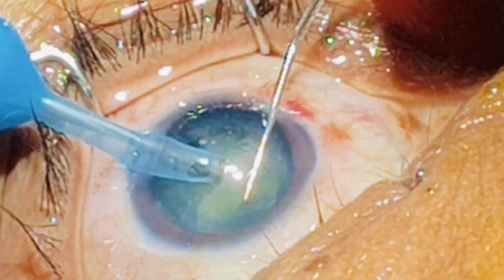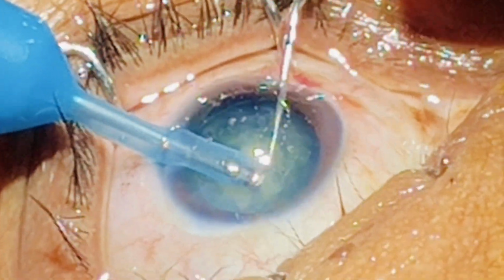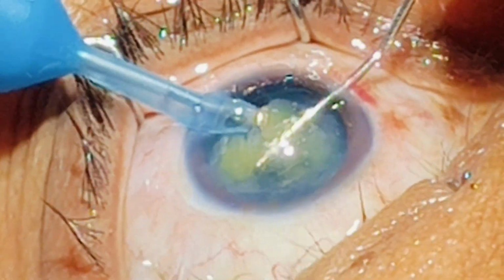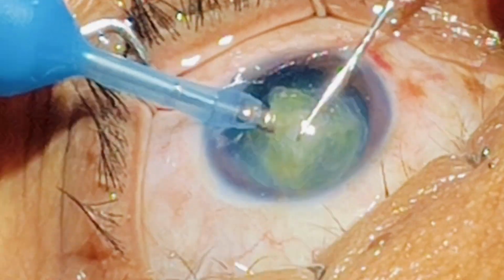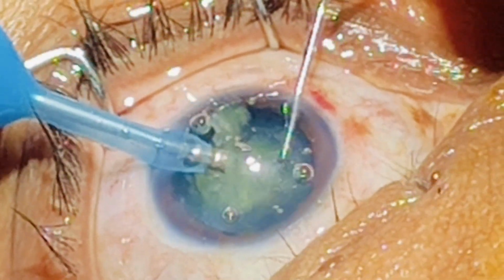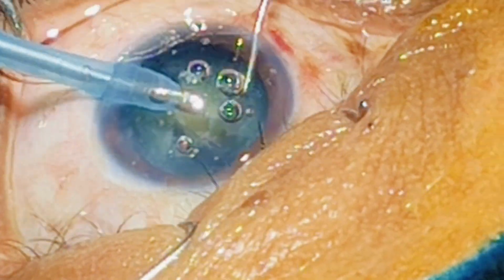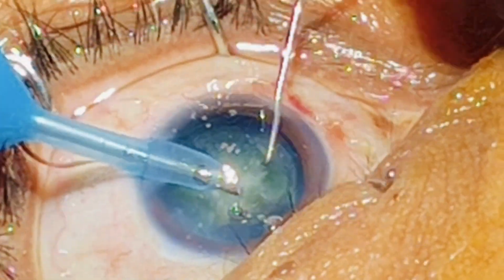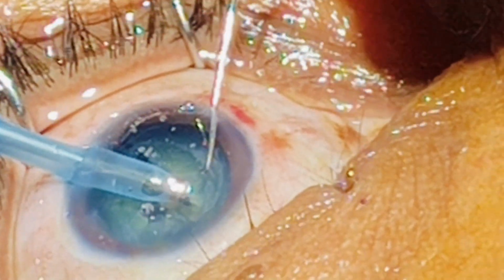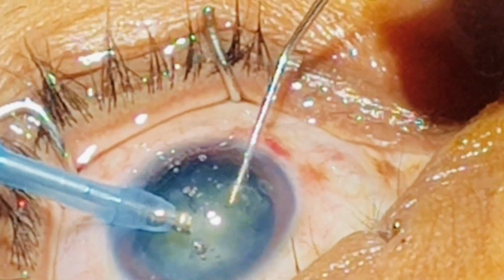The first chop happening means the main tension is over. Then each heminucleus we have to divide into further small fragments. Then I'll bring them to the plane of the iris and emulsify. I never emulsify them in the AC. Always emulsify them at the plane of the iris, or maybe a little below, but never in the AC.